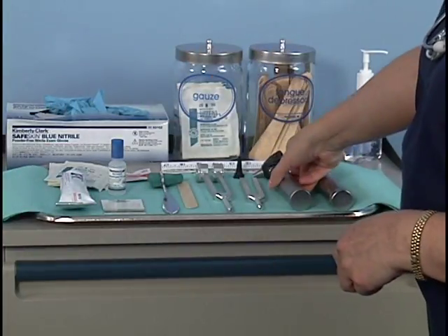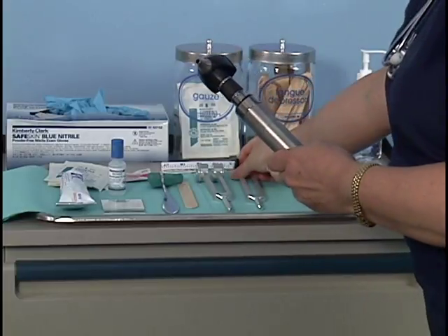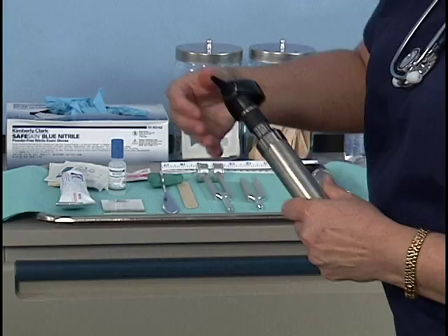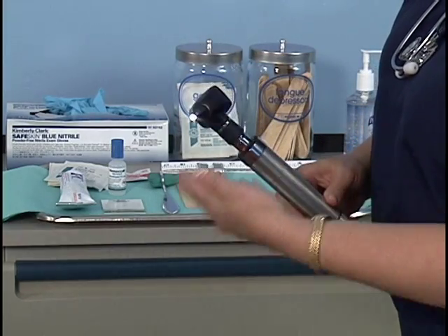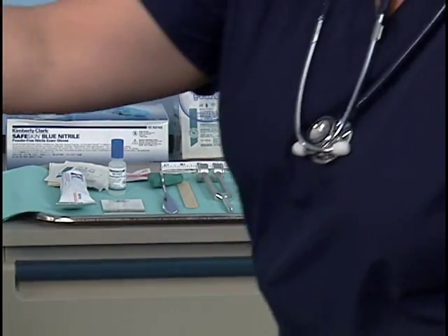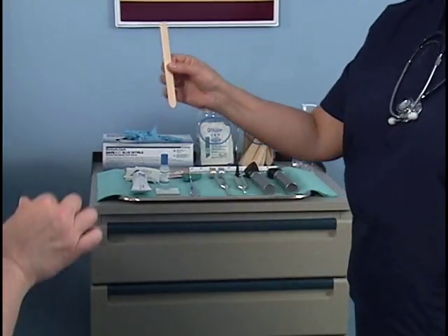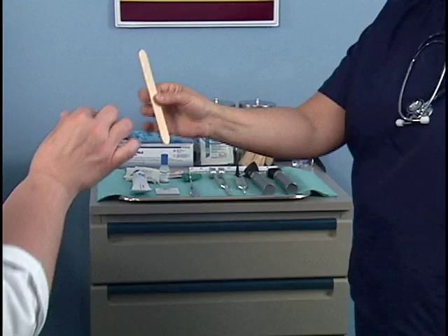Prepare the otoscope by attaching a disposable speculum to it and turning it on. Hand the physician the otoscope when it is requested to examine the patient's ears. Hand the physician the tongue depressor by holding it in the center to prevent touching the part that is placed in the patient's mouth.